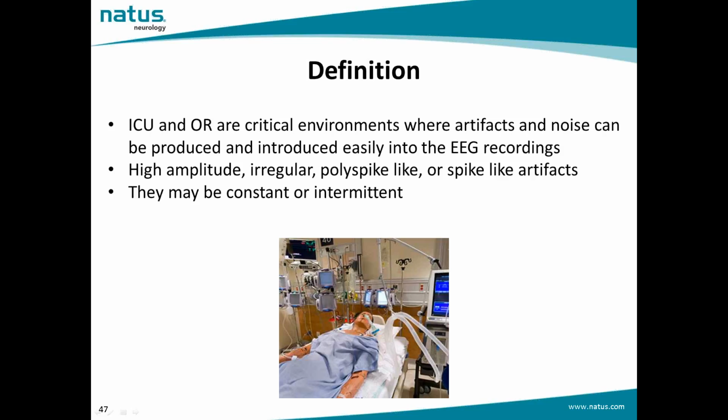For such reasons, it's so common to generate artifacts when the medical staff accidentally touch or push the electrodes and the wires, or when some external medical device is connected to the patient during the monitoring and introduces some noise or artifacts into the EEG recording.